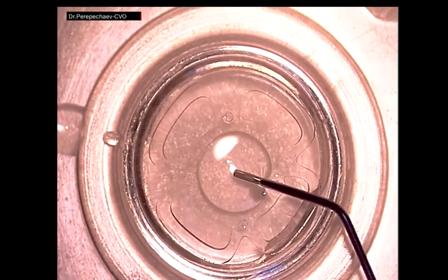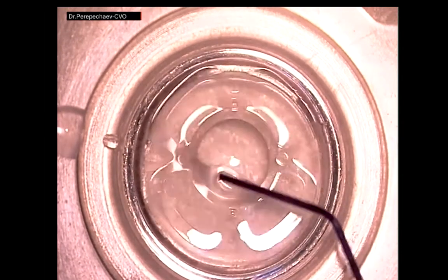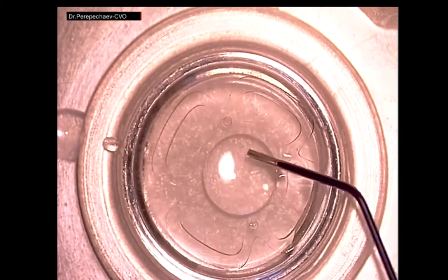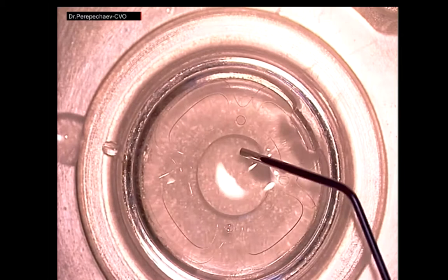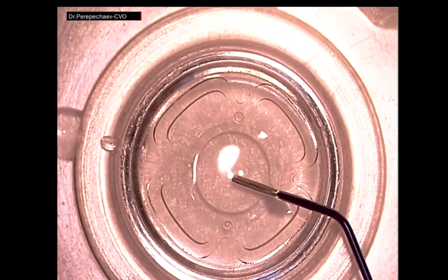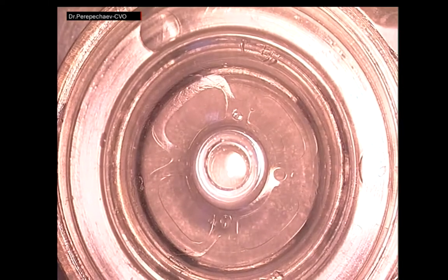and large domestic cats. Despite the fact that the lens is hydrophobic and does not lose its elasticity in the dry state, we recommend that the lens is wetted in saline for 1 to 2 minutes before implantation for greater softness and flexibility than packed in a cartridge.